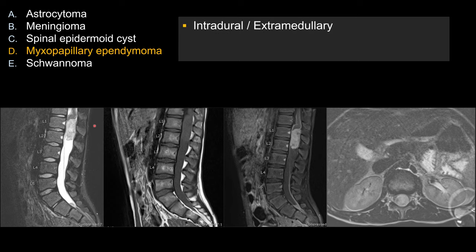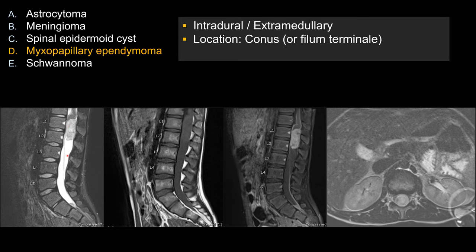First of all, you do notice that there is a mass region that occupies the spinal canal, which is intradural and extramedullary. You can see the conus has been pushed upwards rather than expanding from within, so extramedullary. And it's avidly enhancing. Its location is very typical of myxopapillary ependymoma, in that the vast majority of them occur either by the conus or along the filum terminale.